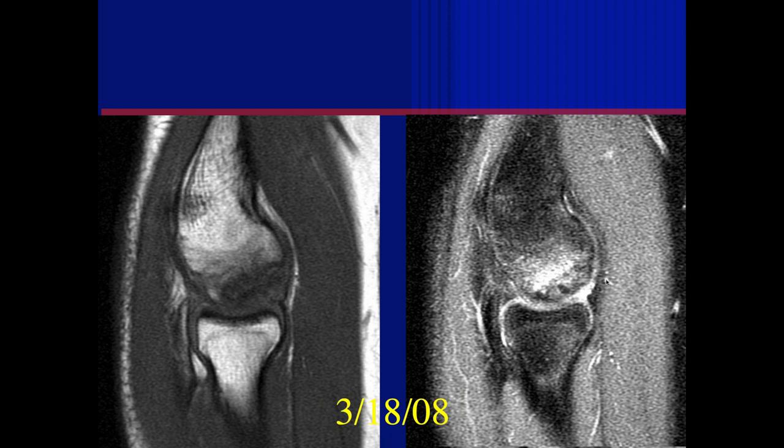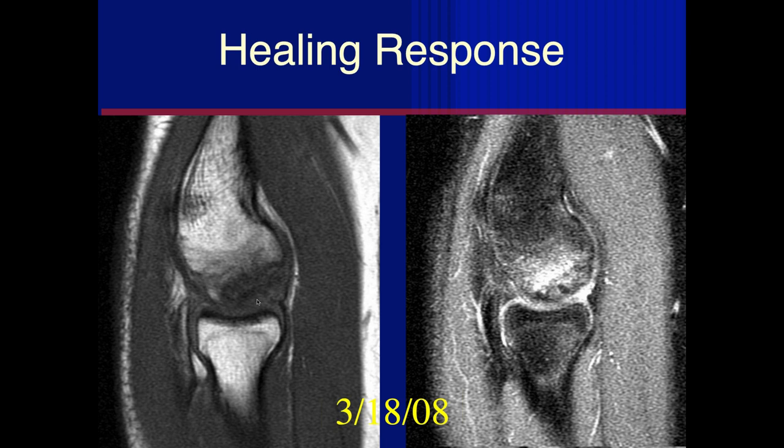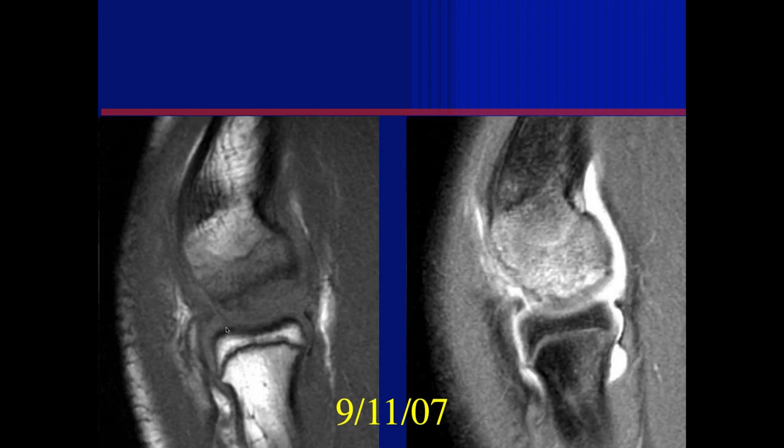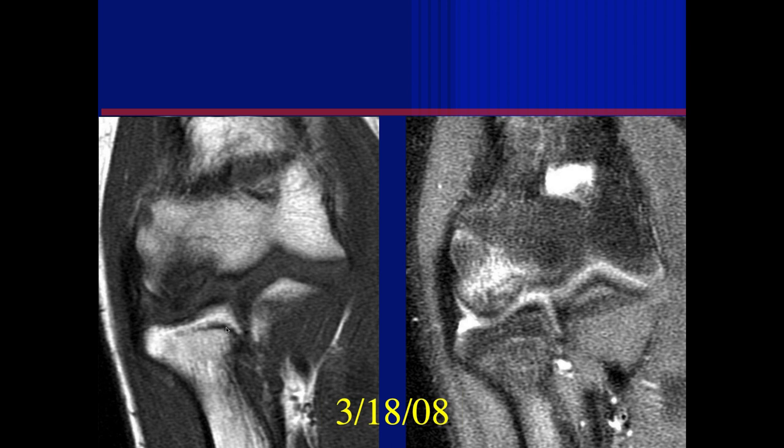At this point, you've lost the articular cartilage, which was mostly intact before, and we're seeing all this granulation tissue underlying it, which is the healing response. But this is the progression of an acute impacted subchondral fracture of the capitellum. And the radial head is now mature. Yeah, if we go back, you can see that you've got more closing of the growth plate in the interval. Right.